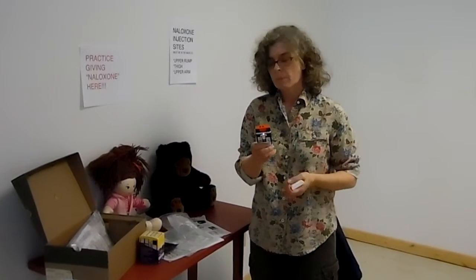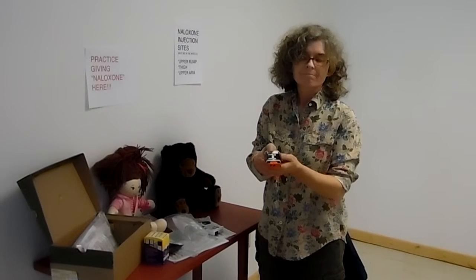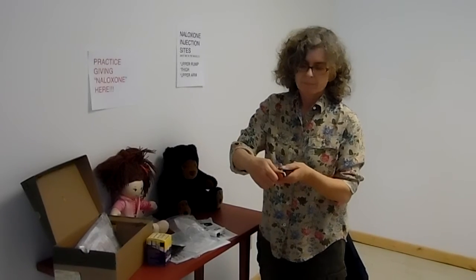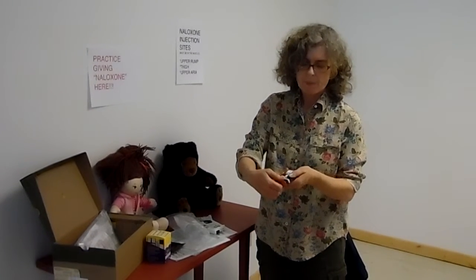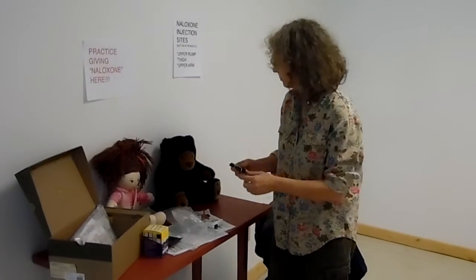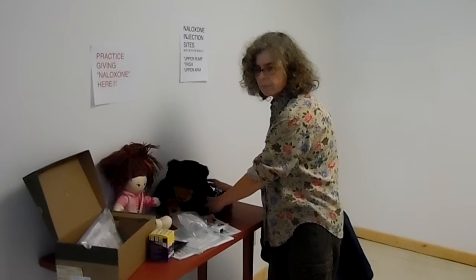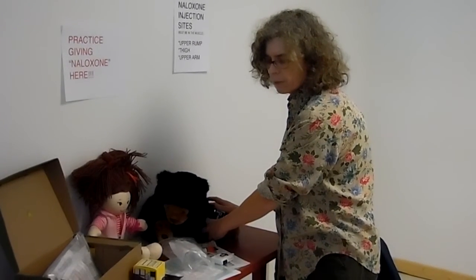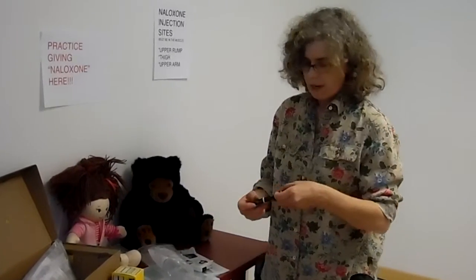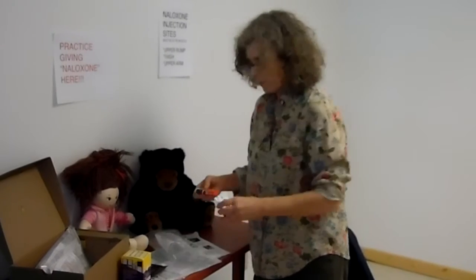This trainer contains no needle or drug. If you are ready to use, pull off to inject. Place black end against outer thigh, then press firmly and hold in place. [Device counts down: Five, four, three, two, one.] Injection complete.